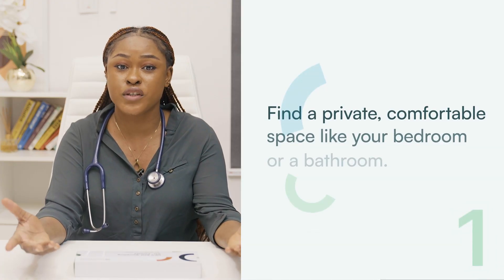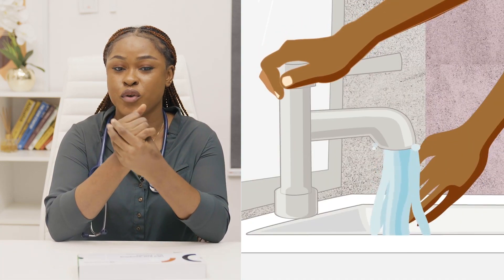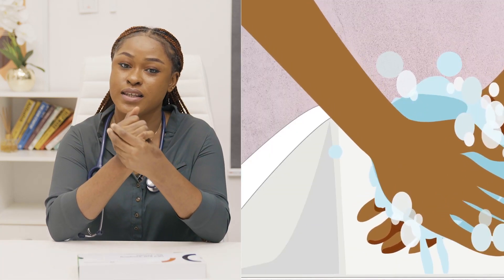Follow the simple steps. Step 1: When using the cervical cancer self-sampling test kit, you need to begin by finding a comfortable space like a bedroom or a bathroom. Step 2: Ensure that you wash your hands properly before using the self-test kit.